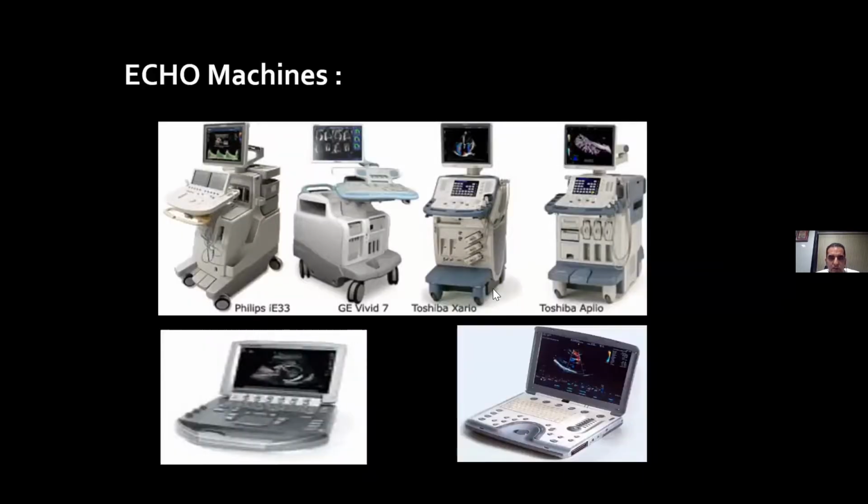Echo machines have been talked about. Don't worry, again I'm just stressing on this. Don't worry which machine you have, which button, because the basic function of the buttons remains the same. So you try to orient yourself to the machine, and you should be well versed with the buttons.